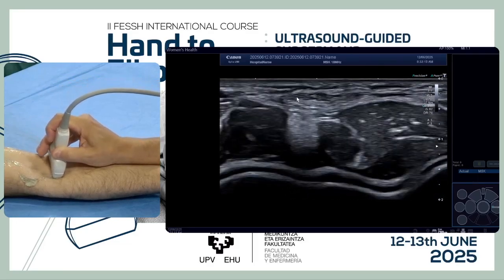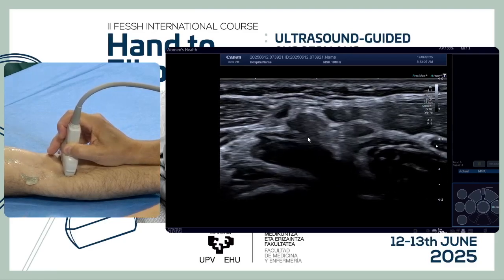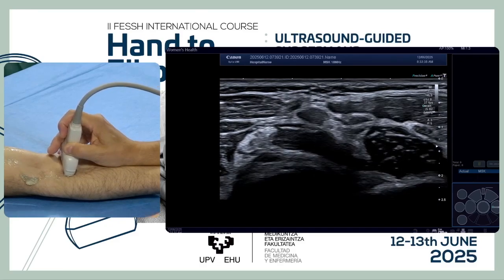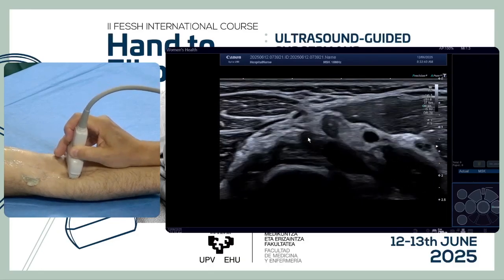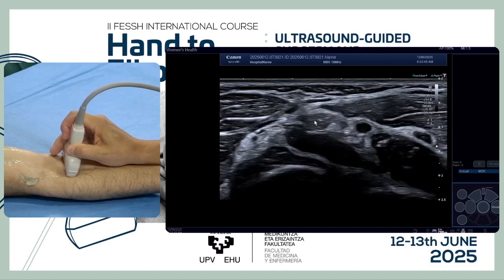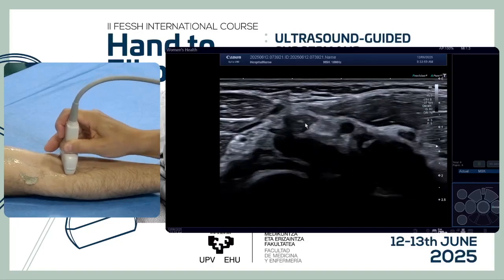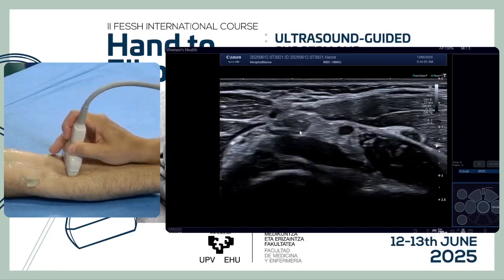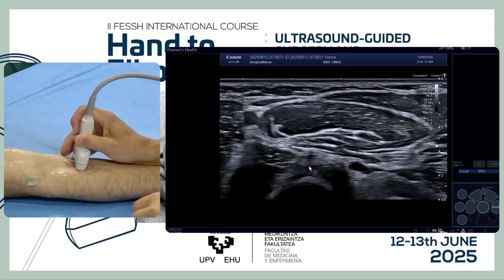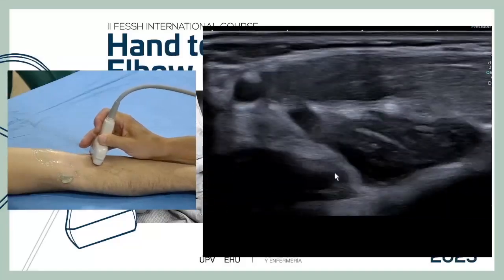Going down, we check the biceps as it tilts counter-clockwise and goes deep. We have to be aware of anisotropy of the biceps: tilting the probe helps us see how it becomes anisotropic, allowing us to find the tendon easily. Moving down into full supination, we can see the insertion of the tendon at the radial tuberosity. This is the starting point for finding the biceps.